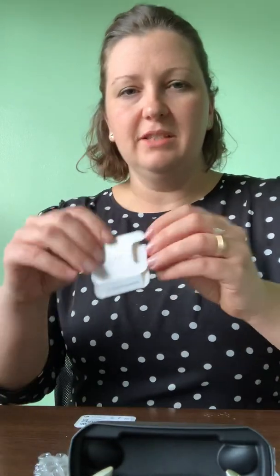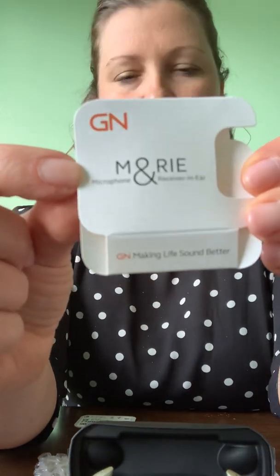These new receivers are called a MARIE receiver — MARIE stands for Microphone And Receiver In Ear — because it's no longer just the speaker. Now the component that sits in the ear is both the microphone and the receiver. So these devices actually function with three microphones per hearing aid, which is absolutely super cool.